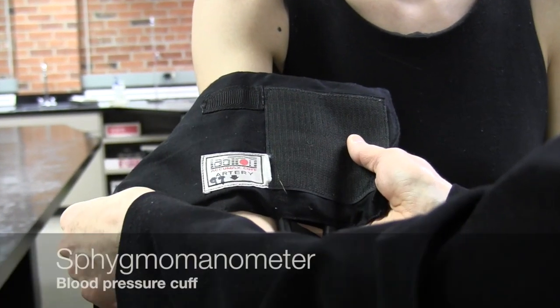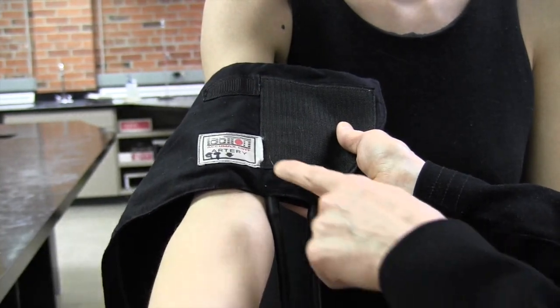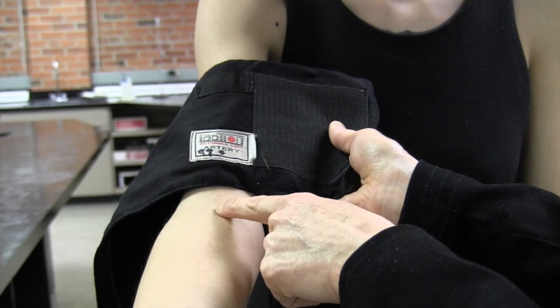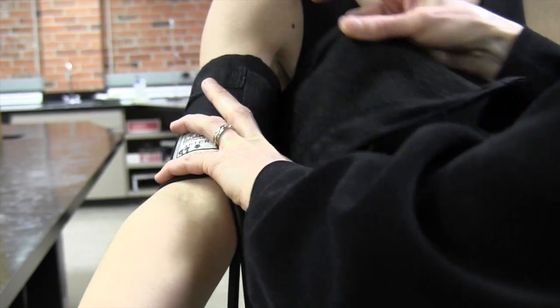Today we're going to take blood pressure using a sphygmomanometer or blood pressure cuff. We'll start by placing it on the arm with the arrow in line with the middle of the inside of the elbow, and then we'll wrap it around making sure it's fairly snug.